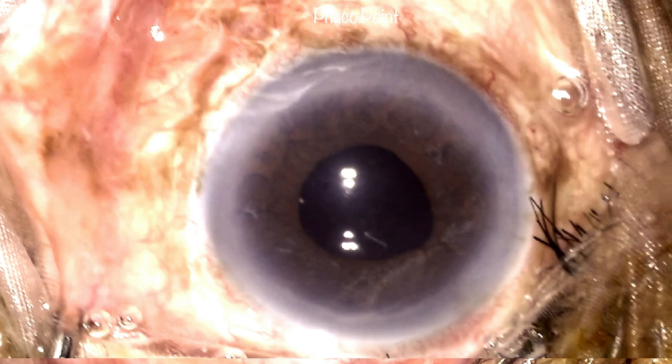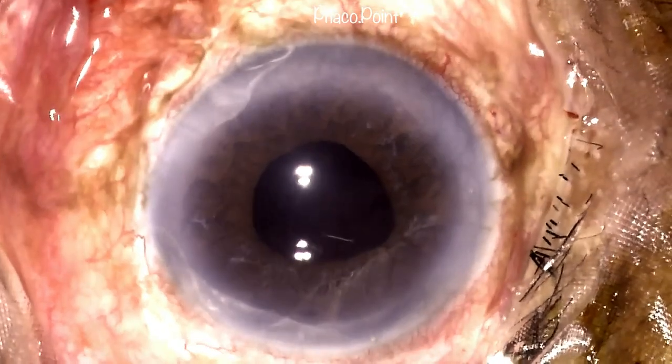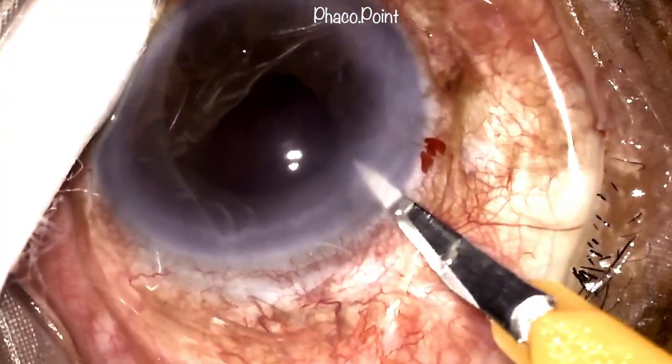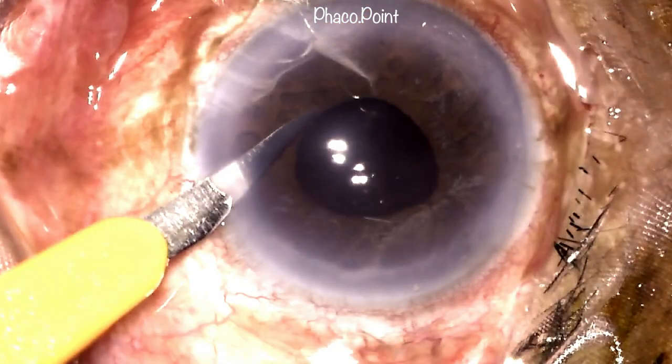At this point, we took the decision to use a pair of intraocular scissors to cut the vitreous strand. Here's what we did. Since the surgery was not done by me, I chose to make incisions which would make it very comfortable for me to perform this procedure. I'd like you to note how the incision that is taken needs to be wide enough to allow for the easy entry of an intraocular scissors. Moreover, the incision opposite the area of the vitreous prolapse is going to be used to introduce intraocular forceps to gain easy access to the strand that needs to be cut.